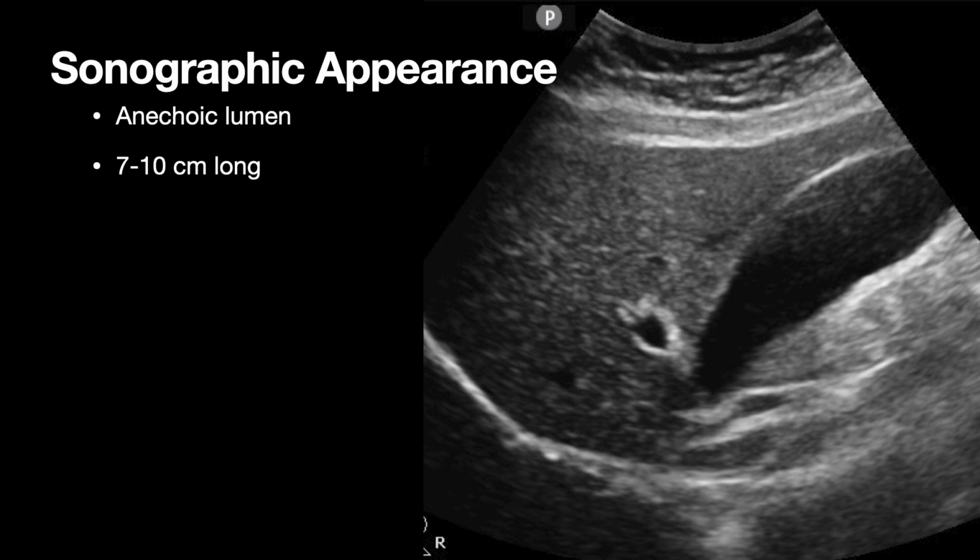And that can happen. Oftentimes, the intestines adjacent to the gallbladder are filled with air, and they're going to have that typical air signature. However, one of the things that you can notice is fluid-filled intestines, and it can trick you a little bit. So as I'm scanning, right, I go to the place, I find something that's fluid-filled, right?